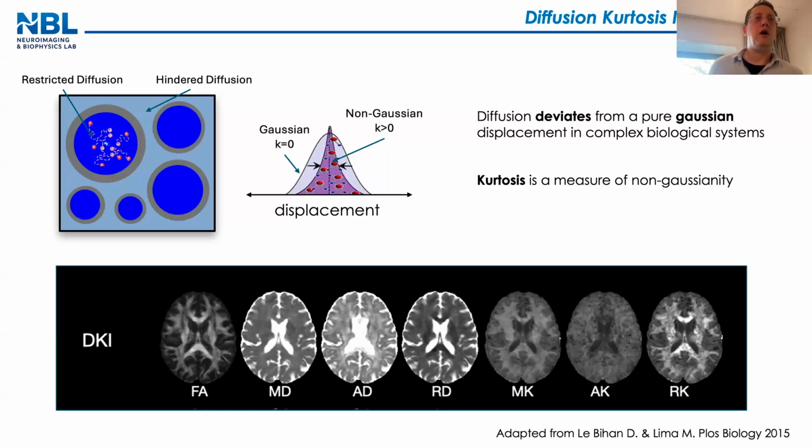Yep. Sorry, I'm not sure I get how you come from one single measurement to a distribution, like in this case. Is it only from the multishell? If you have a Gaussian distribution as a model, you just need one acquisition, one sample, okay, because Gaussian distribution means exponential decay. Non-Gaussian distribution means multi-exponential decay. I see. Okay, so that's the link.